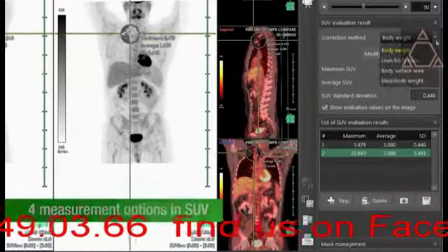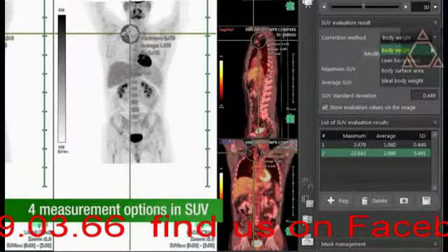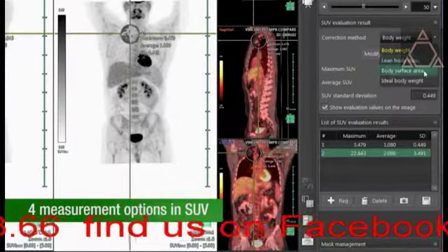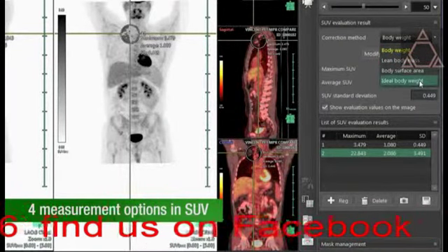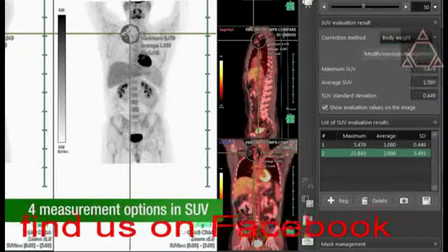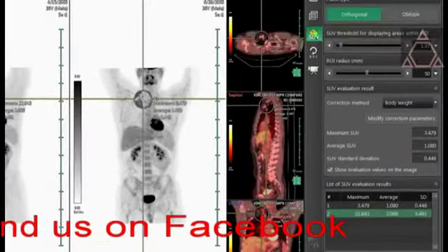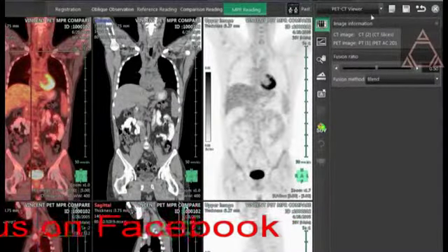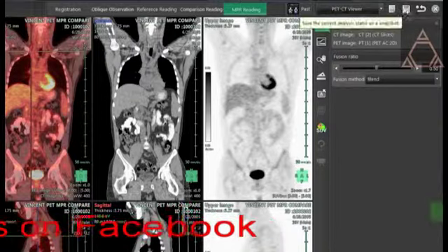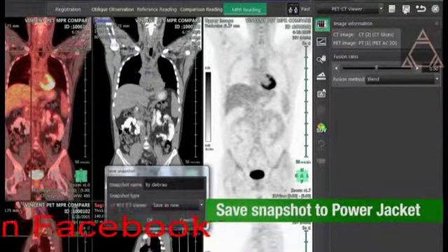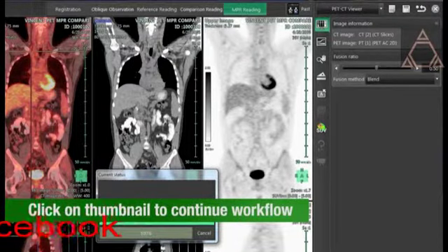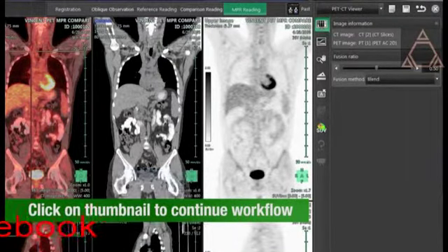Choose from four different measurement options: body weight, lean body mass, body surface area, and ideal body weight. Then return to the current study and either end the study or first save a snapshot. A second user can continue the workflow simply by clicking on the thumbnail in the power jacket.